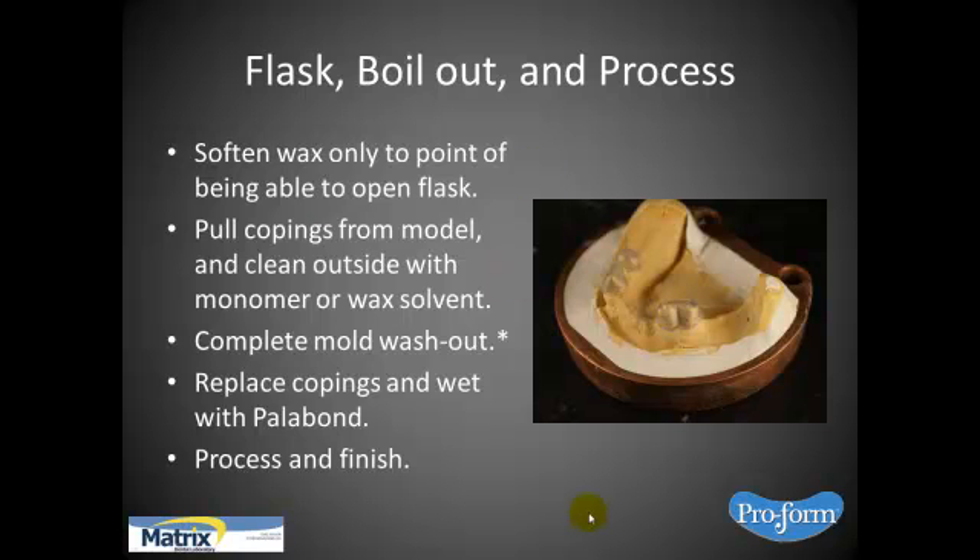Soften the wax only to the point of being able to open the flask, then pull the copings from the model and clean everything out with a dental-specific mold cleaner like Ultra Wash or something of that nature. Then put the copings back on top. I take a little wax solvent to get all the wax residue off as best as possible, then replace your copings. What I do then is wet it with Palabond or Vitacol — either one. The point is you want to get some solvent action going on so that you get good adherence when you pack-press the case.